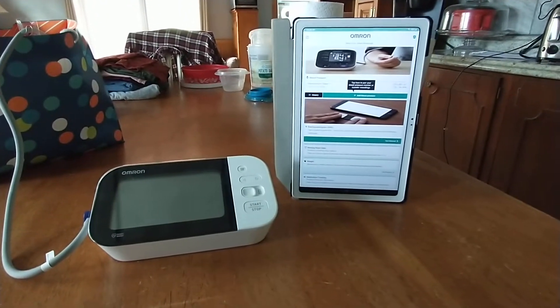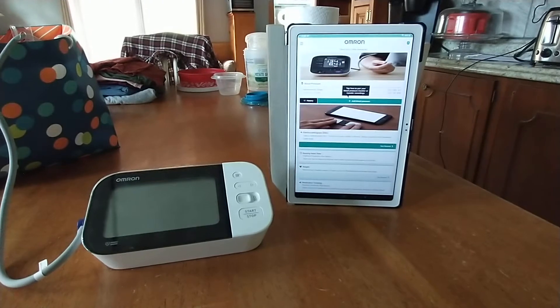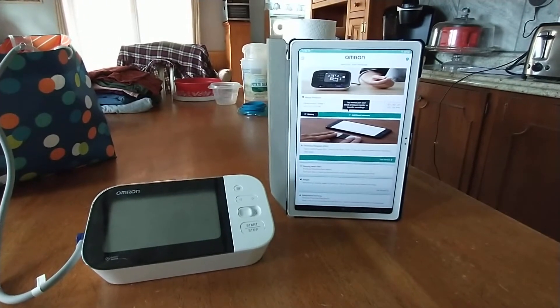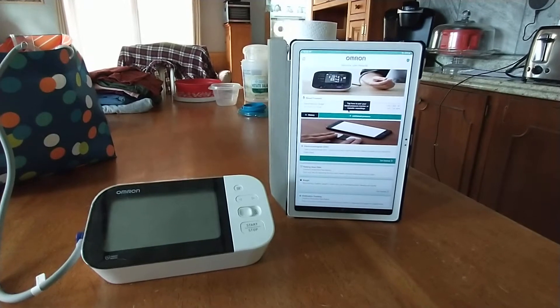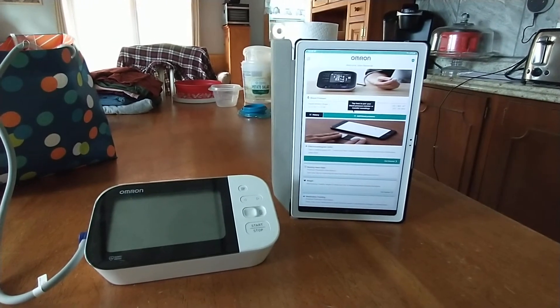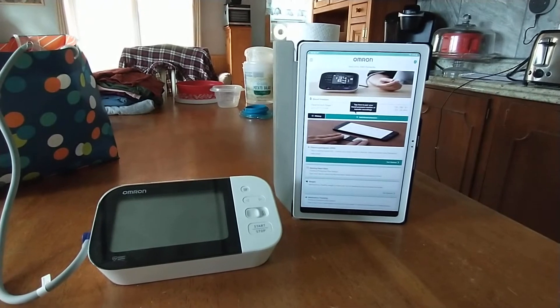A lot of people seem to be having trouble pairing their Omron blood pressure monitor to their phone and transferring recordings. I think I've found how to do it. This is my process and you can try this and hopefully it'll work for yours.